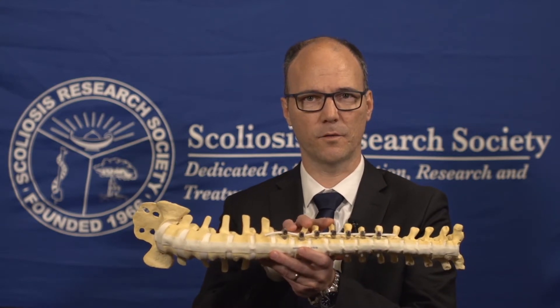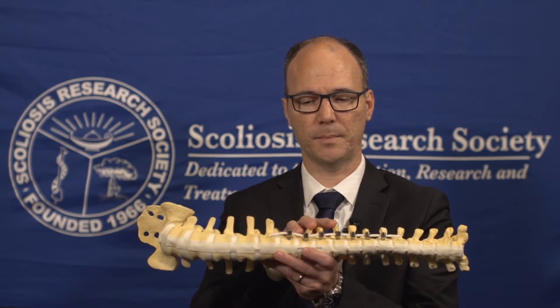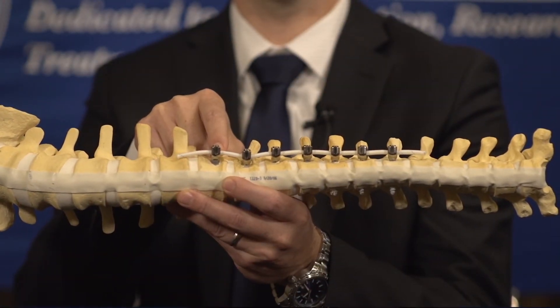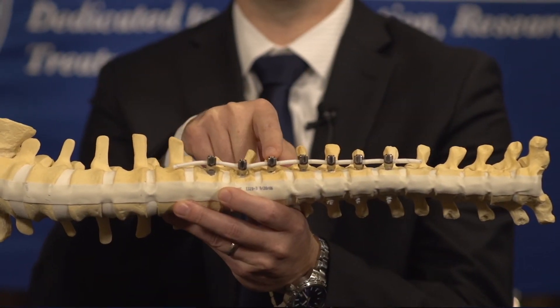There are typically two types of tension-based devices. The first one is staples — they attach the vertebral bodies across the disk space, and they're inserted via a minimally invasive approach. The second one is this one: a vertebral body tether. We apply it on the convex side. There's a screw in every vertebral body, and then there's a cable attaching it.